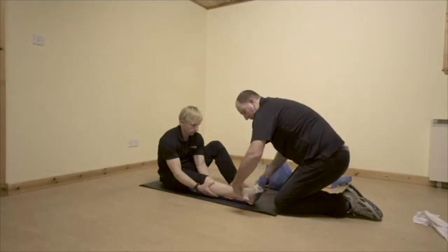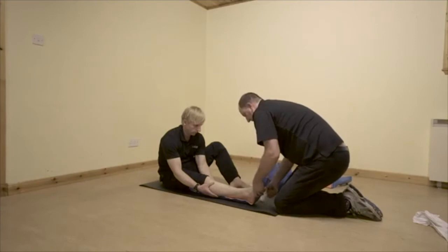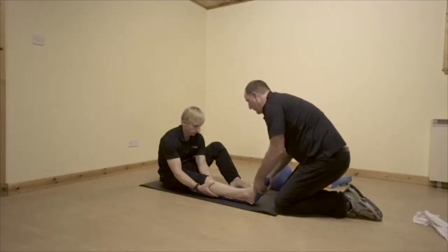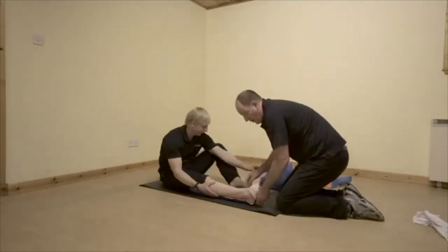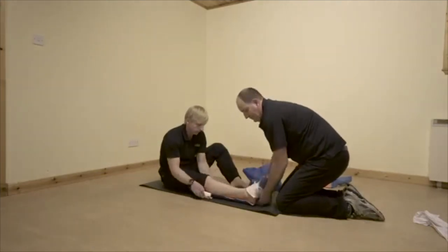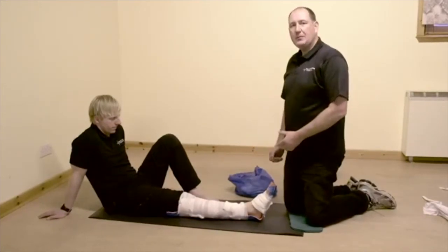Tom, once I've got this one on, we're going to get another one - can you help me unroll these bandages around your leg? If I had some duct tape or gaffer tape I would use that - it'd be quicker and easier - but we'll just use these bandages for now. I'm going to slowly start working up Tom's leg, getting these bandages nice and firmly in place. It's taken a few minutes, but we've managed to strap Tom's leg up against the Sam splint so it can't move.